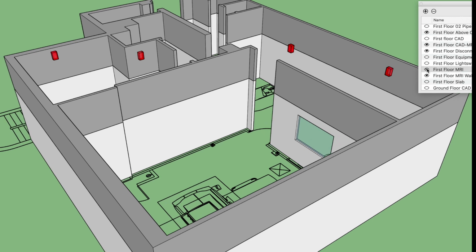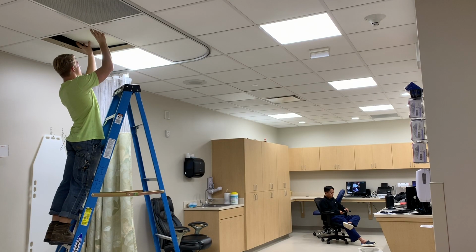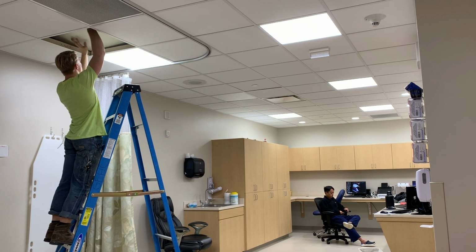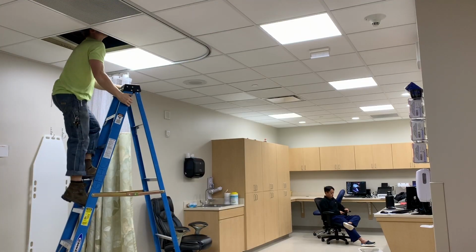There are 2 disconnects in the control room. This is your first disconnect, Reheat 1, or RH1 as it's labeled. Open up the tile and look on your right, and you can check to see if the switch has ever been tripped.